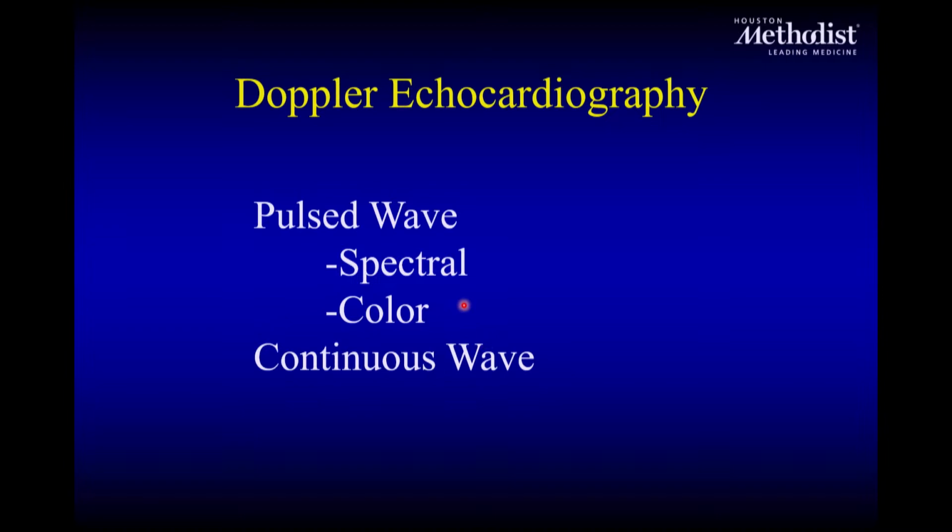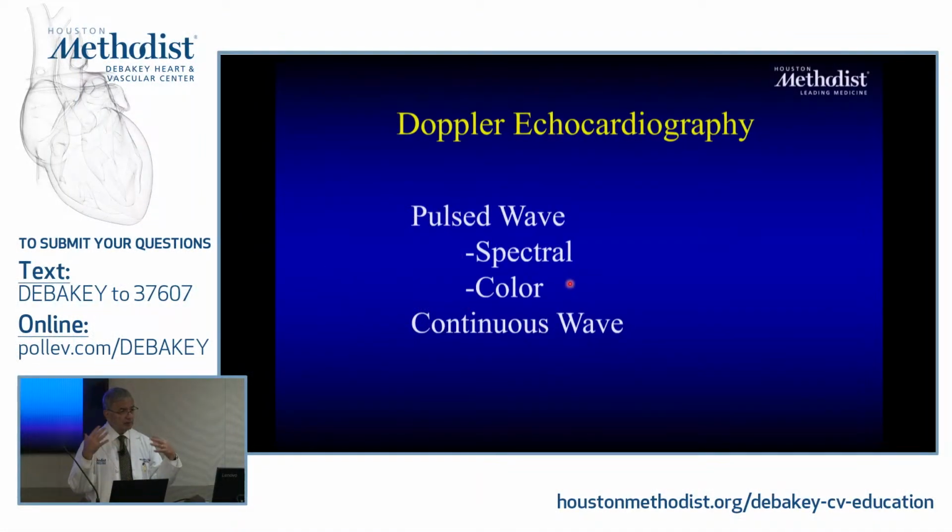So this first section is all imaging per se, and Doppler is a different section. So remember, imaging is sending bursts of ultrasound, processing it, knowing when it comes back and how much time it takes, so I know where to put it in my image. I could do simultaneous processing, so I can increase my frame rate. You want as high a frame rate as possible, close to 100 even, to almost real-time imaging. And structures that are much denser, much more reflective, would tell me something about them. They're either metallic or calcifications, et cetera. And I can use harmonic to improve my imaging overall.